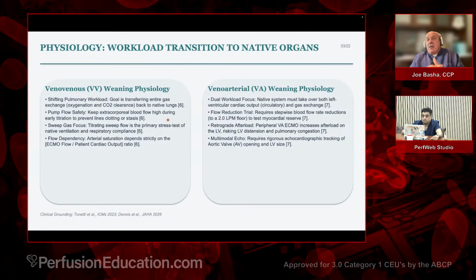Now, if you're really anticoagulated, your PTT is above 200, or immeasurable, like would be on bypass, well, that really doesn't matter. You can get away with it. But frequently that is not the case. Your PTT is going to be between 50 and 70, somewhere in that range normally, maybe down around 40. It just depends. If you follow ACC, the SCCM guidelines, it's 1.5 baseline.